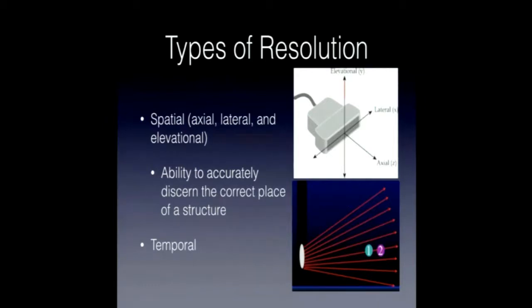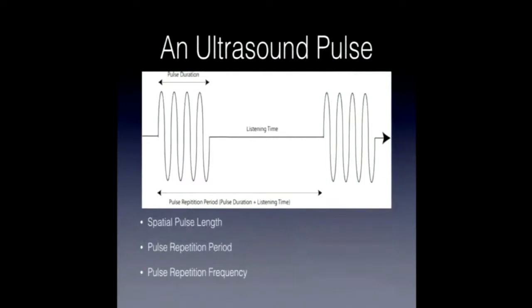So we're not fooled by something. It's actually, it is what we see. So that's resolution. And before I talk more about axial resolution, I just need to mention briefly how an ultrasound works, and I'll sort of jump around a bit, but I need to discuss this in order to discuss axial resolution. So the ultrasound sends out a pulse, and then it listens.